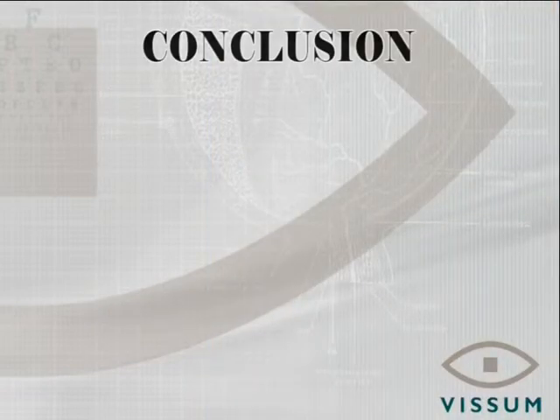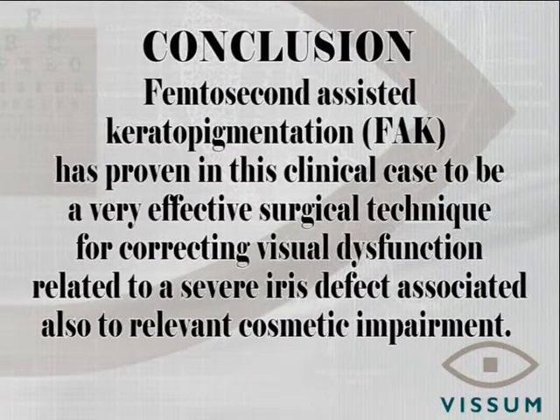In conclusion, keratopigmentation has proven in this case to be a very effective and safe surgical technique for the correction of visual dysfunction related to iris defects that could be accompanied with a relevant cosmetic impairment in the patient.